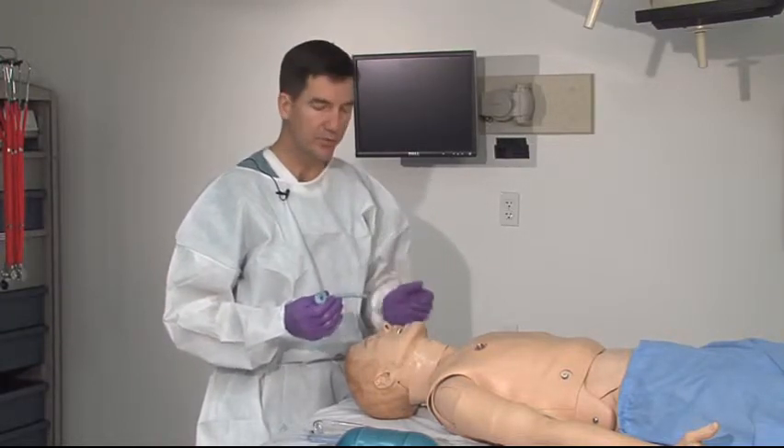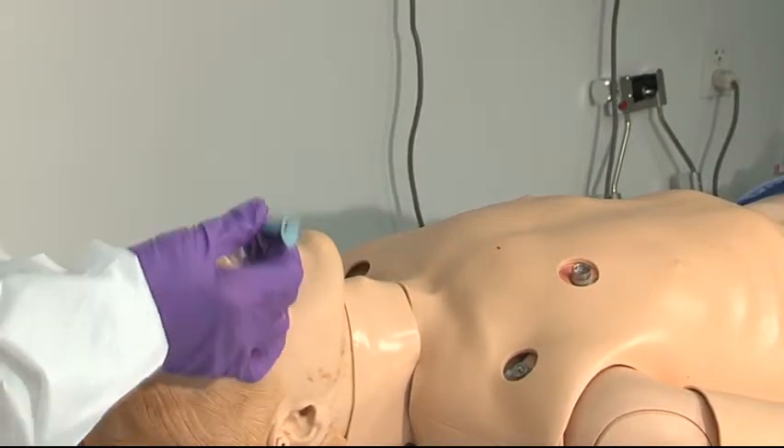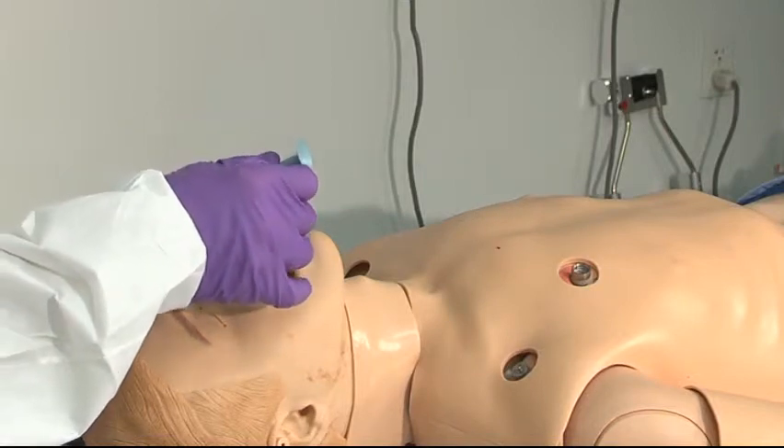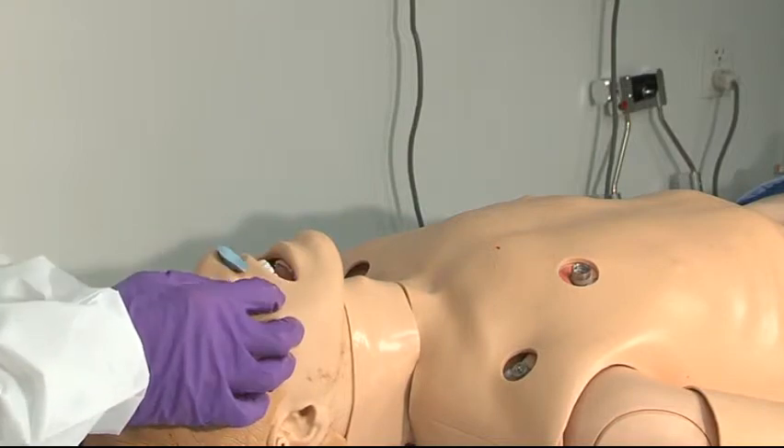Once you coat it with a little bit of lubricant, you warn the patient that they'll feel a little bit of pressure in the nose, and the placement is straight back along the floor of the nose. The airway seats very comfortably.